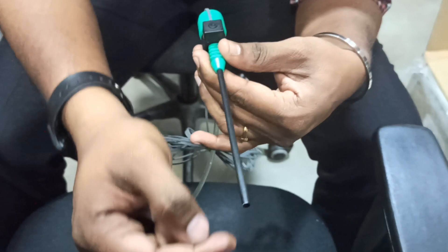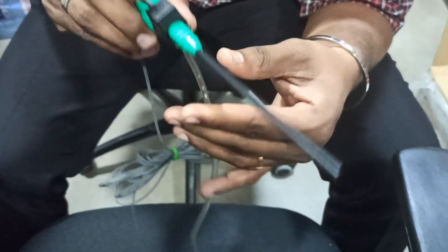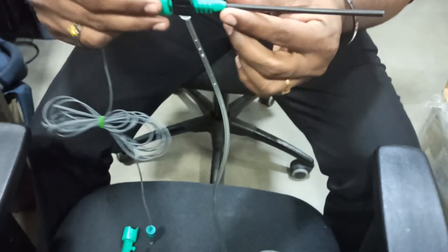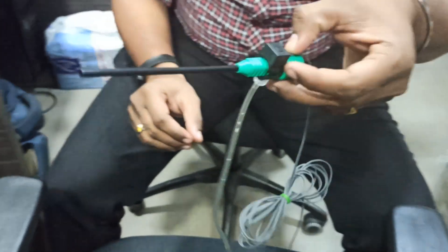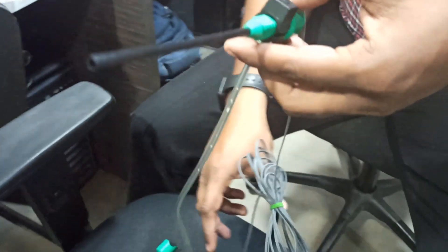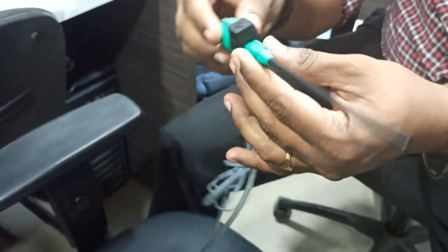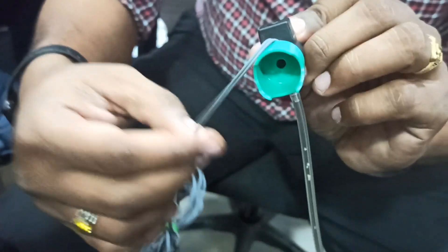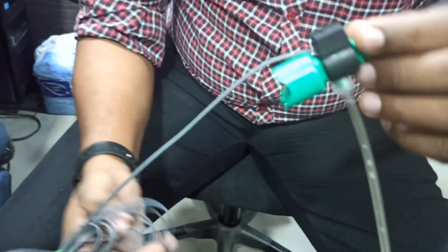The water will be flowing at this tip. This is the setup — you can see how the setup is done. You can set it up like this and place it in the scope. Check all the directions and that's all. Thank you.